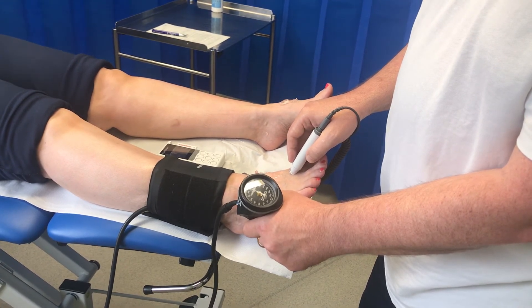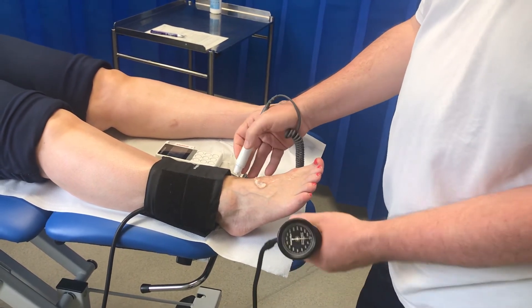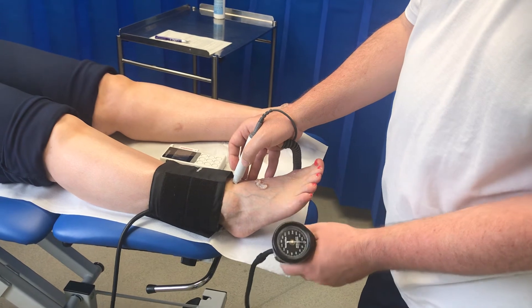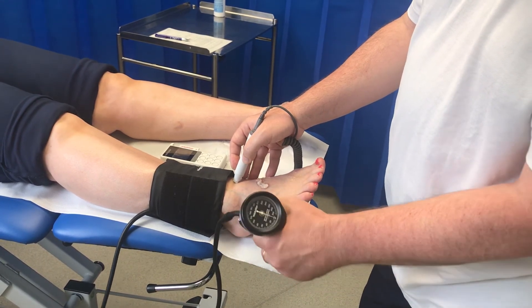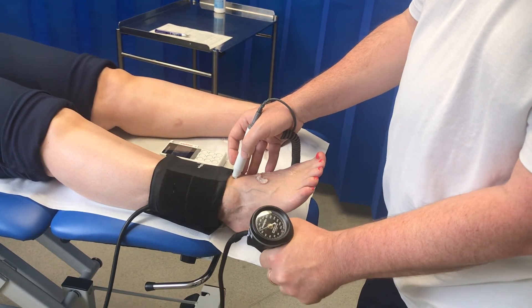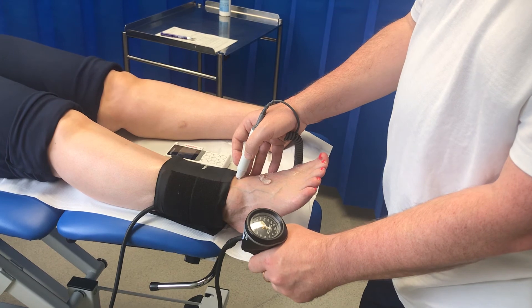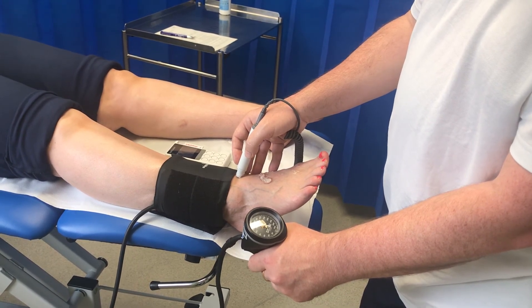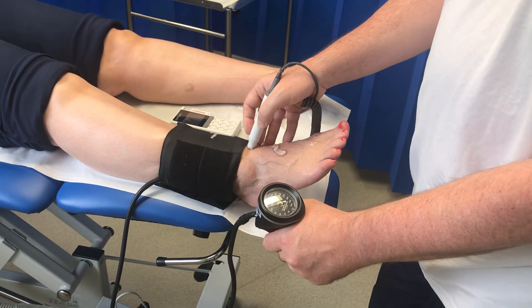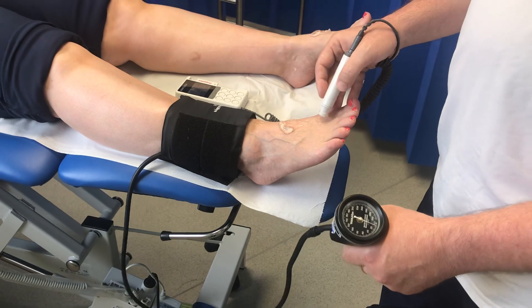Deflate slowly until that sound comes in. Another place you can look is across the ankle crease — just have another listen there. We can hear a fairly quiet sound, which might mean we're slightly off the artery. We've had a good reading from this point, so I'll now move on.